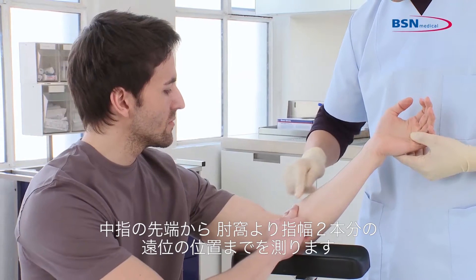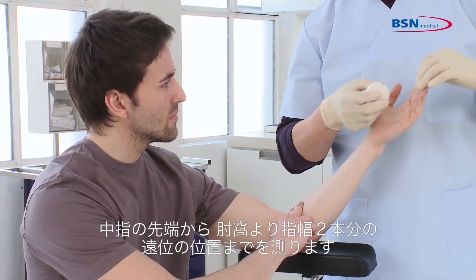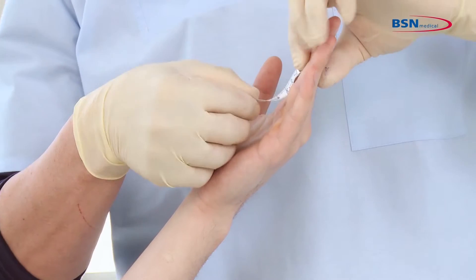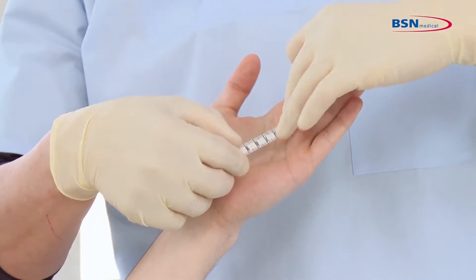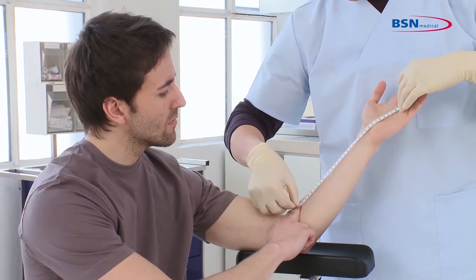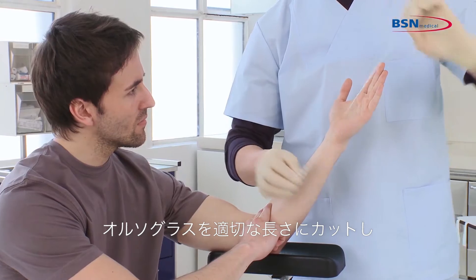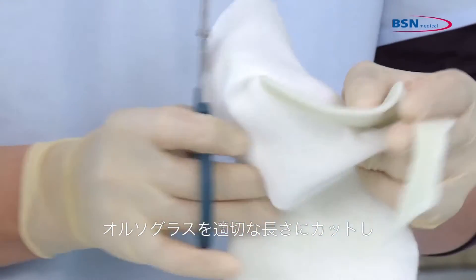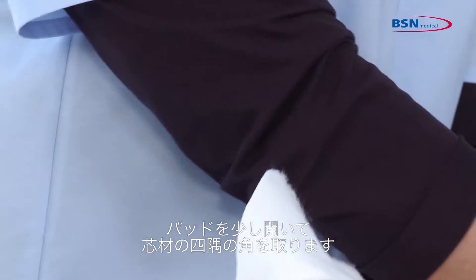To begin, measure from the tip of the middle finger two finger widths below the antecubital. Then, cut the desired length of the splint, open the padding a bit and round all four edges of the substrate.